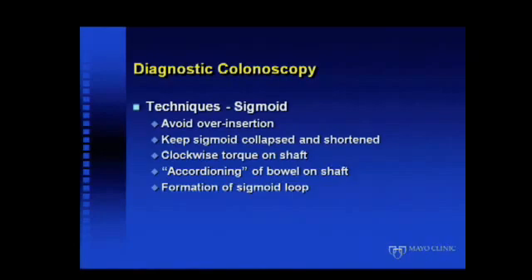You start with a straighter scope before entering the sigmoid colon. In the sigmoid colon, it's important to avoid overinsertion — pushing the scope in too far without keeping the sigmoid colon telescoped onto the shaft. Overinserting and establishing too much of a loop sets one up for failure later by having too much redundancy and paradoxical movement. It's important to keep the sigmoid colon short and collapsed down onto the scope, by short in-and-out movements of the colonoscope as it's being advanced. I find it helpful to keep any twisting motion in a clockwise direction, which keeps the sigmoid colon rotated along the left side of the patient's abdominal wall.